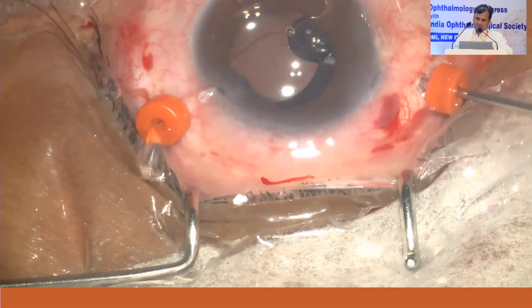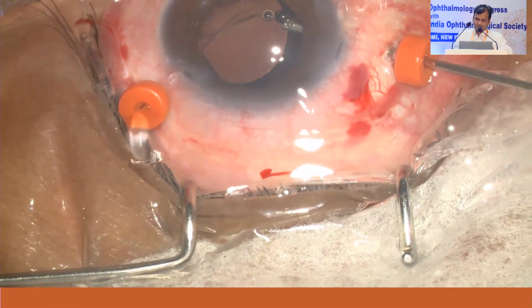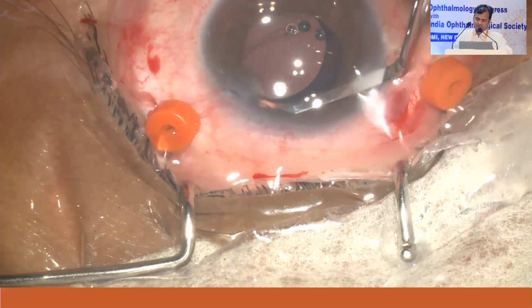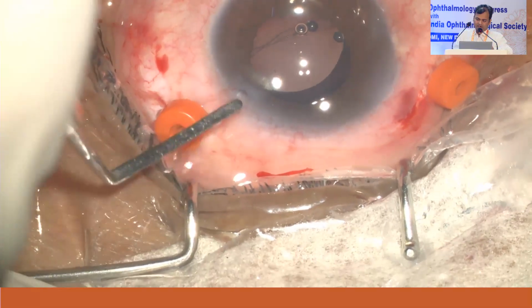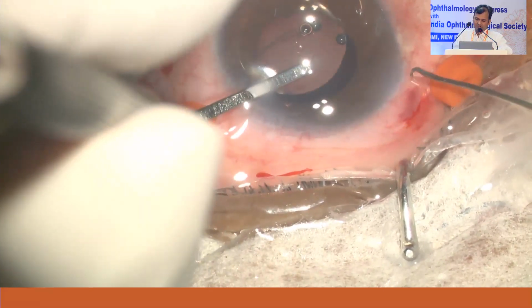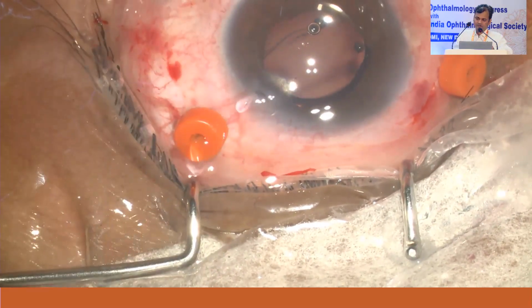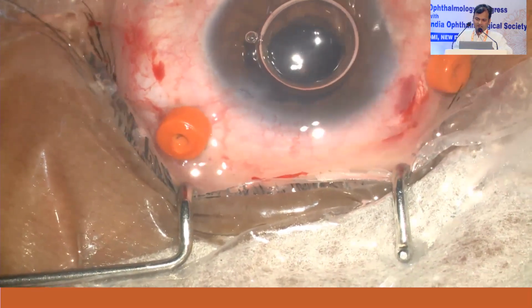And after doing a good vitrectomy, you see that there is no iris vitreous tag. If you are sure, then you can see once again that proper support is there, without pulling the iris. And also you will inspect for any cortical matter lying there. And then you can implant your lens in the sulcus.